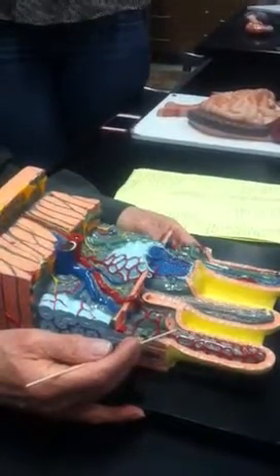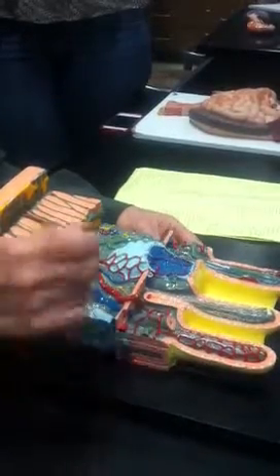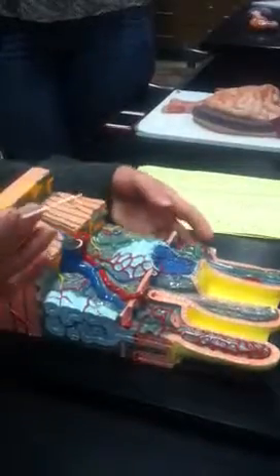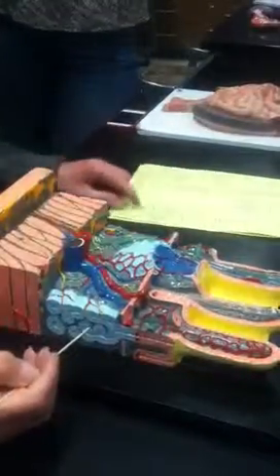Lacteal, columnar epithelial cells, Paneth cells, okay, goblet cells, which I've mentioned, all of these little blue things, goblet cells. Lamina propria is the connective tissue, the interstitial tissue. All the gray stuff, if I point to anything gray, that's lamina propria.